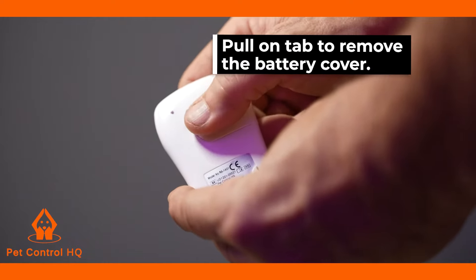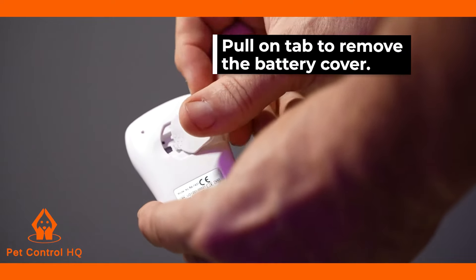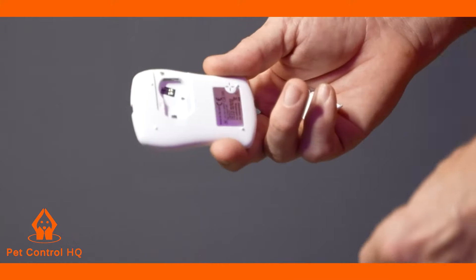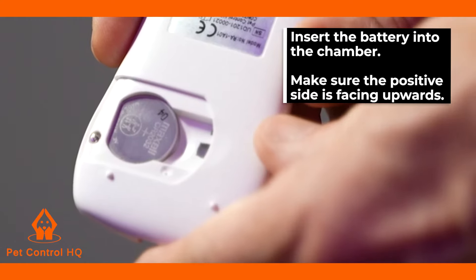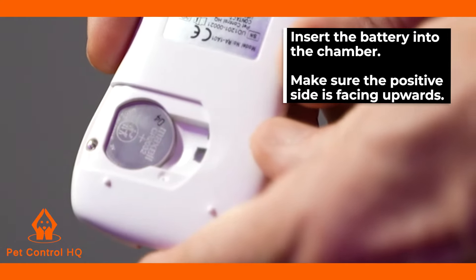At the back of the meter, slide the battery cover off by pulling on the tab. Insert the battery into the battery chamber and make certain the positive, or plus sign, side of the battery is facing up.